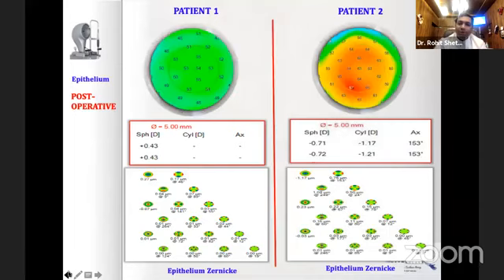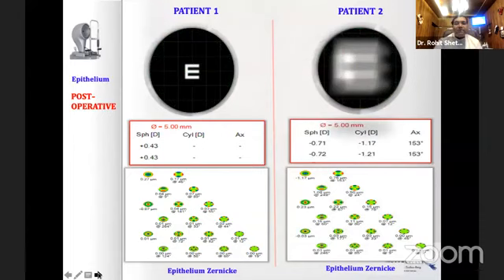I did see some fantastic surgery videos of Mohan sir, and a lot of you are fantastic cataract surgeons, but at the end of it, if your ocular surface is bad for your premium surgery, and your epithelium itself would induce a diopter of cylinder only on the epithelial surface, then the whole thing beats the purpose.